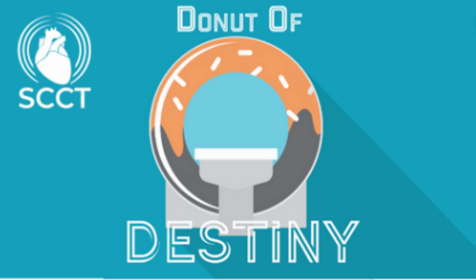I think from a clinical practice perspective, there's one area we're looking at right now, and we have a clinical trial that should enroll its last patients this week. It's called the P3 trial, out of Bernard de Bruyne's lab in Aalst in Belgium. They're using our planner product to predict pre- and post-PCI FFR CT values and doing a direct comparison against measured FFR with a motorized pullback pressure wire.